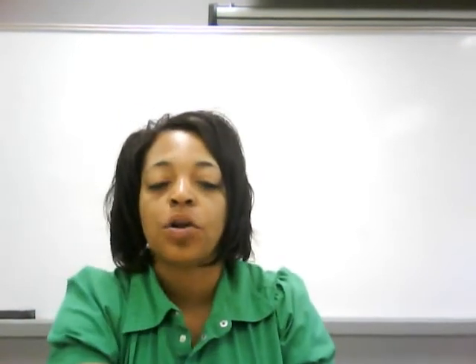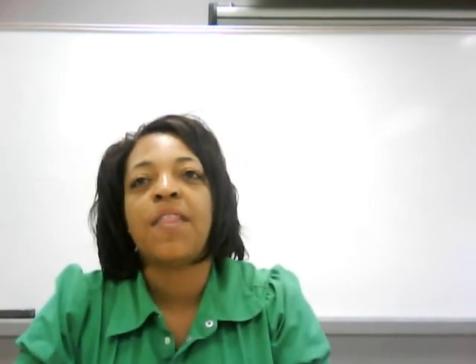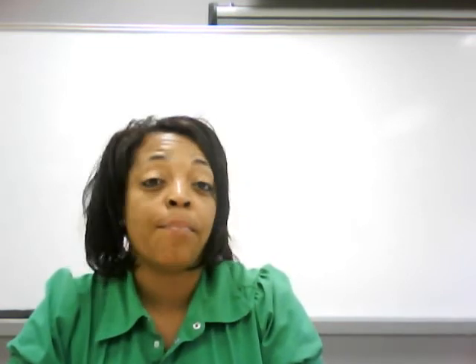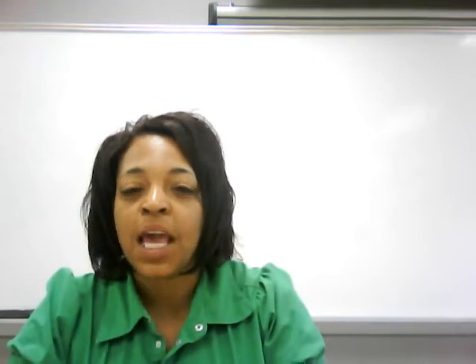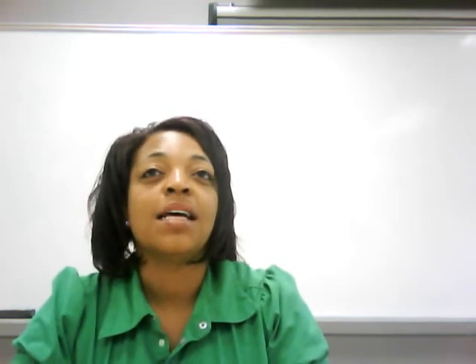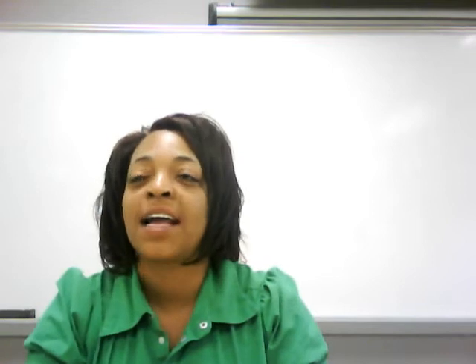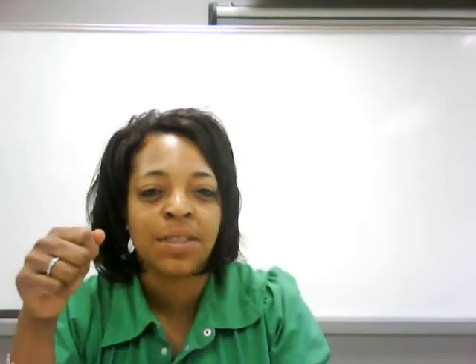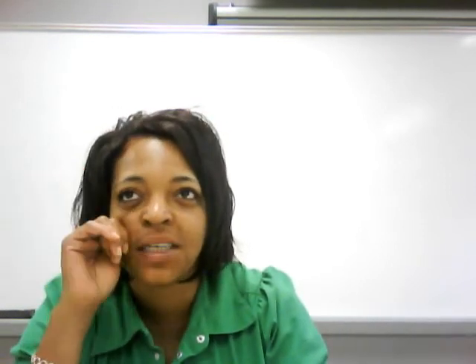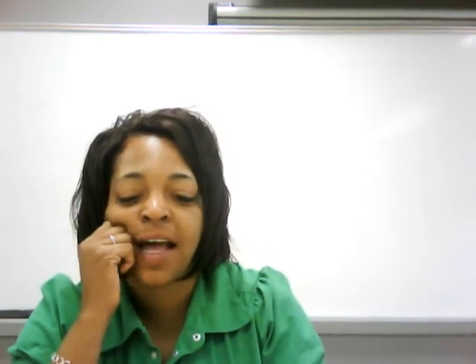Now, what we're going to also learn about today is something that we call distortion. Distortion is something that, let's say, for example, if you have a picture of an apple, and you look at that picture and that picture looks a certain way. Well, then let's imagine if you take a magnifying glass. You know, you take a magnifying glass sometimes and look at an ant, and the ant looks bigger, or it looks like it's shaped a little bit different than if you just looked at it with your naked eye instead of with the magnifying glass.